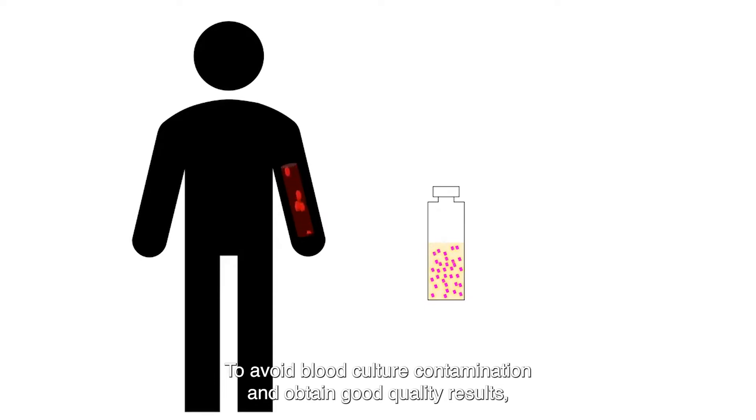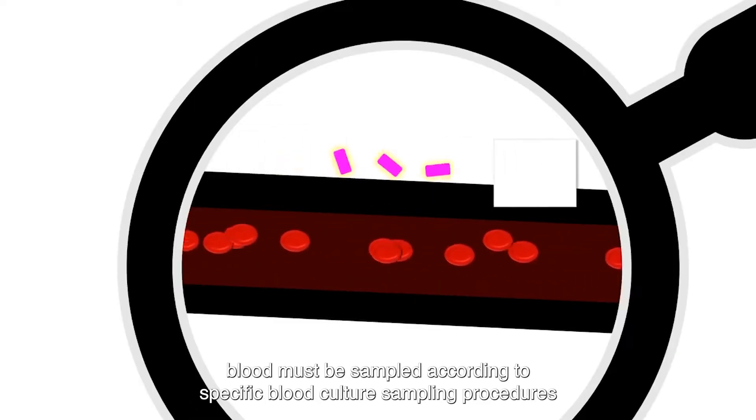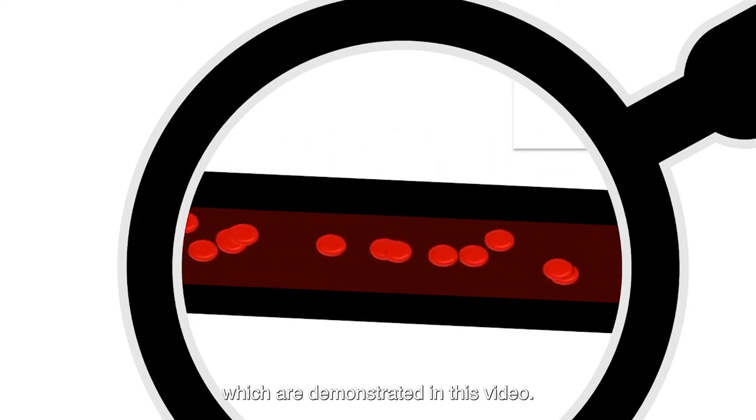To avoid blood culture contamination and obtain good quality results, blood must be sampled according to specific blood culture sampling procedures, which are demonstrated in this video.